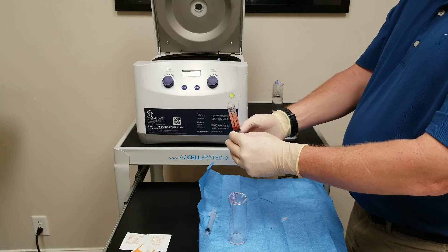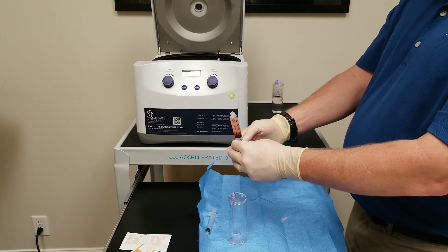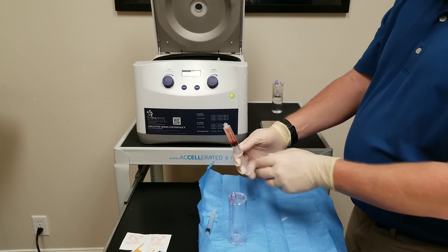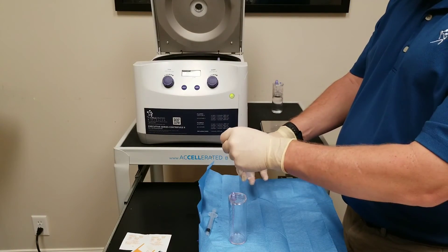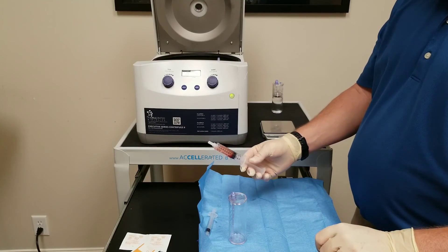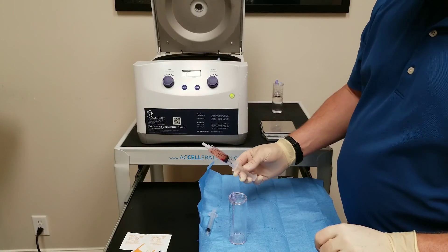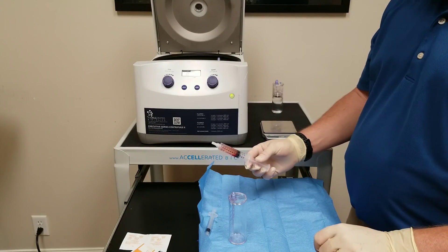This can stay at room temperature for one to four hours — you'll be fine. If you don't do an immediate injection, there are sterile caps that come with the device, so just cap it off so there's no exposure to the air. Any more questions, you can call Accelerated Biologics at 1-800-367-0844 or acceleratedbiologics.com.